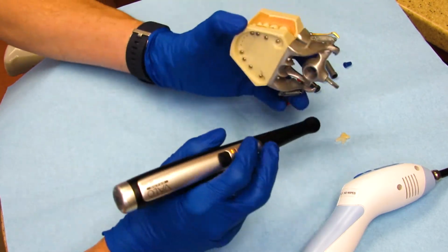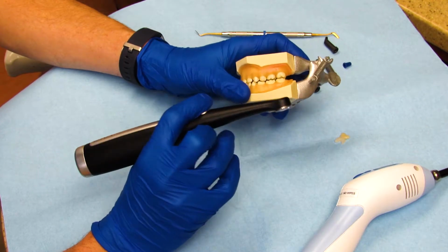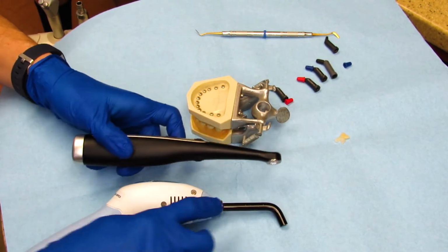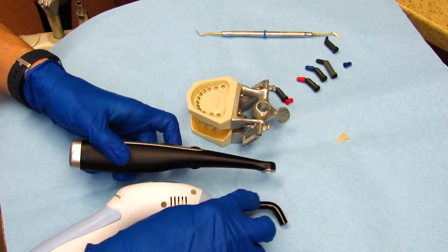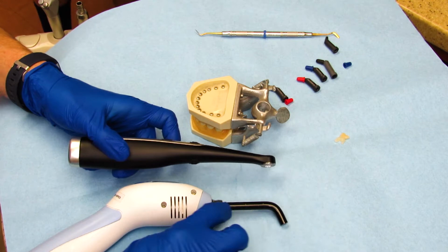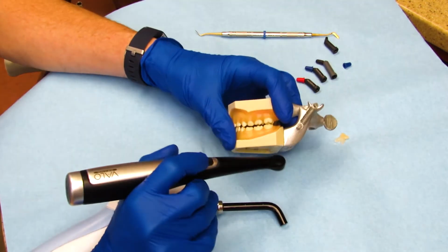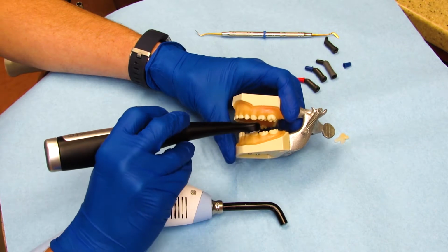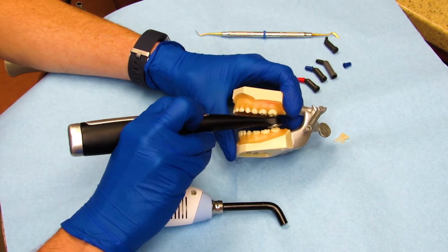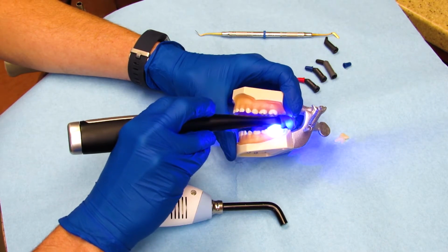Now the other advantage about this for you, especially as a patient, is this fast curing light is the angle at which the light comes out. This one is straight and it's a very narrow tip, whereas this one has a curve on it. So this is a model of a child's mouth. If I were to do a filling on the farthest back tooth, you can see how I don't have to really have the child open very wide. You can cure right there.